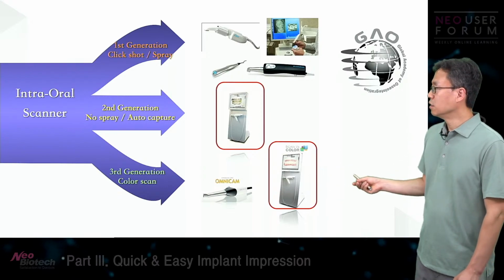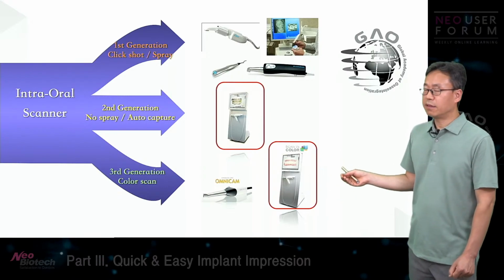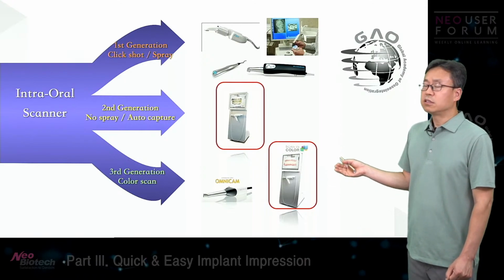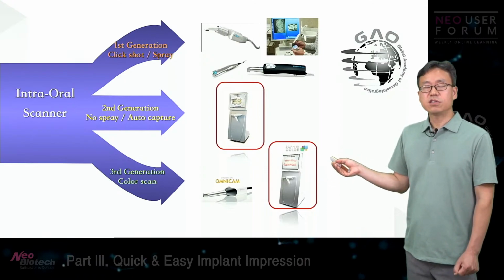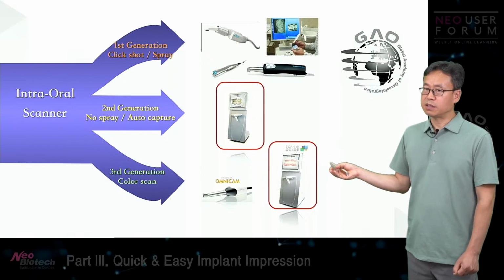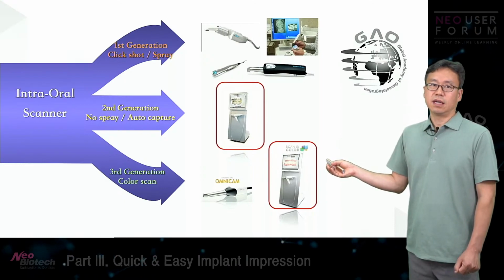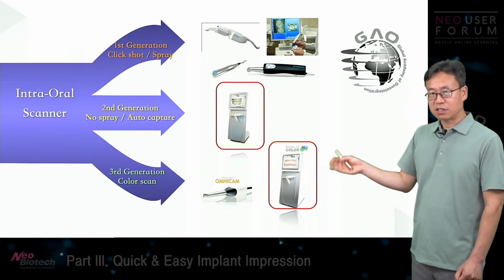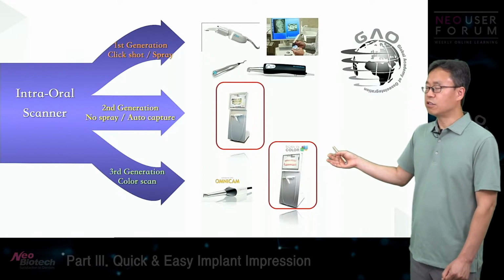Let's shift gears and move on to something different. For more than 20 years, intraoral scanners have improved quite significantly. I will not talk about the accuracy or the versatility of these intraoral scanners today.